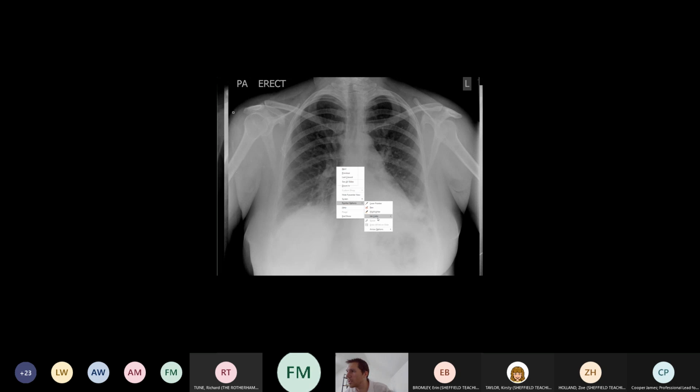So most things will naturally go down that right side. The left main bronchus comes across at a slightly more acute angle. So anything going down there, most of it will continue into the right lung. So a marble will impact there. If I aspirate, like I say, my glass of water, it will all start pooling down here. So if I aspirate when I'm stood up, that's where it will go. So I'll get consolidation down here.